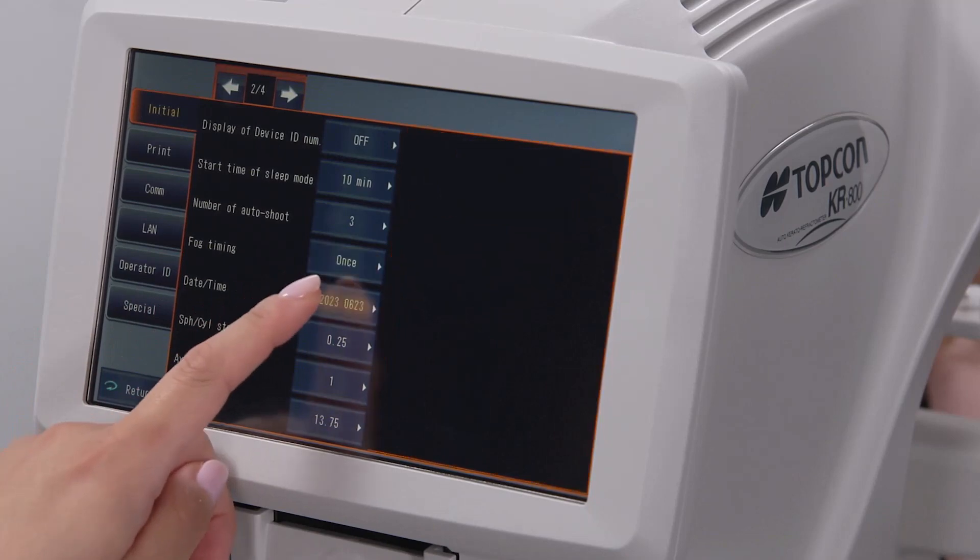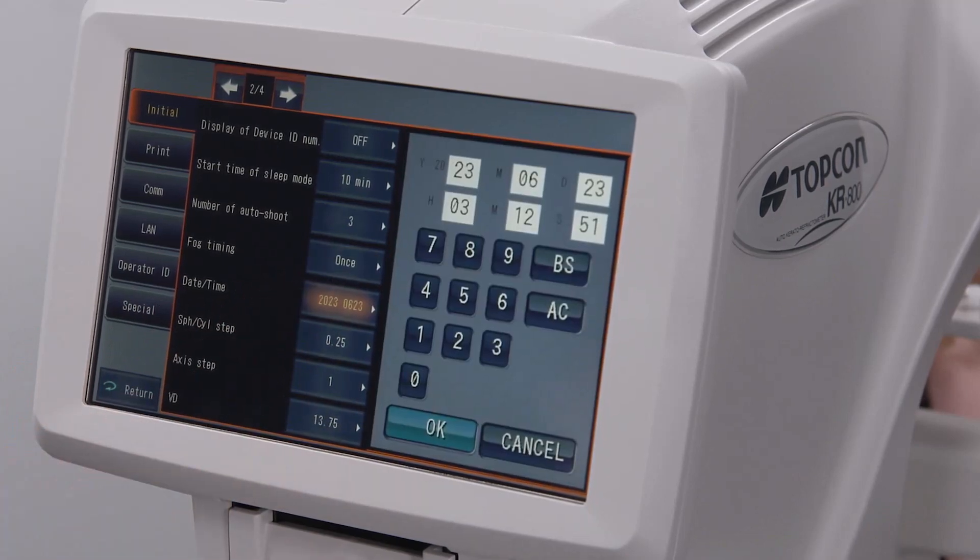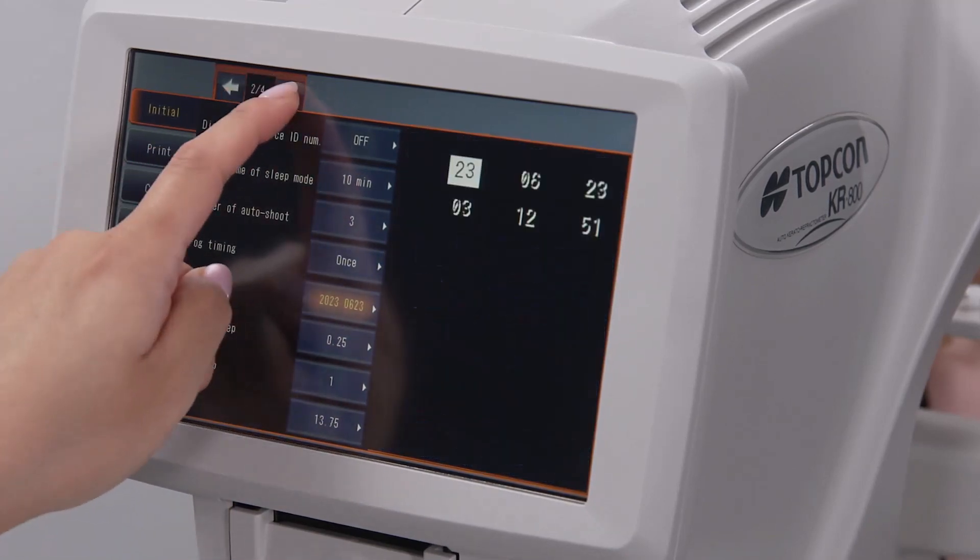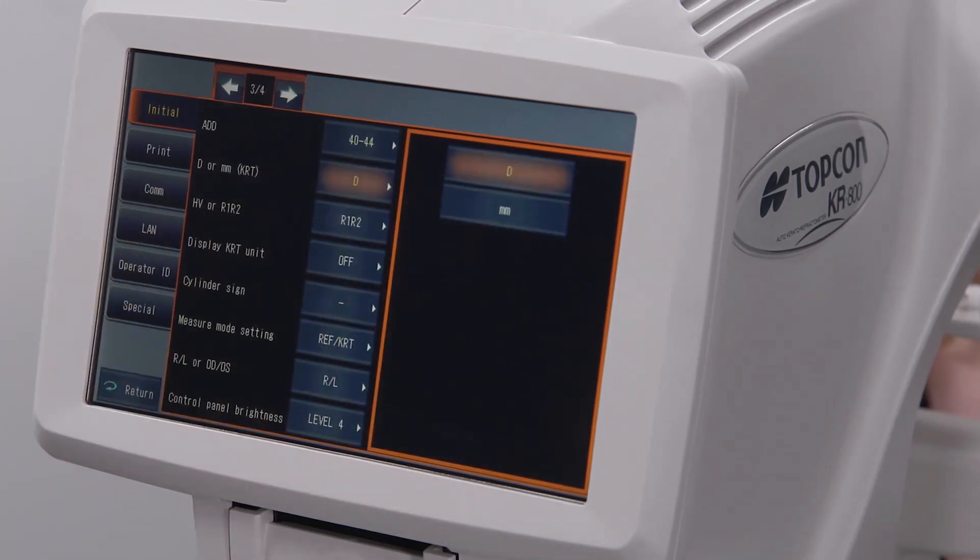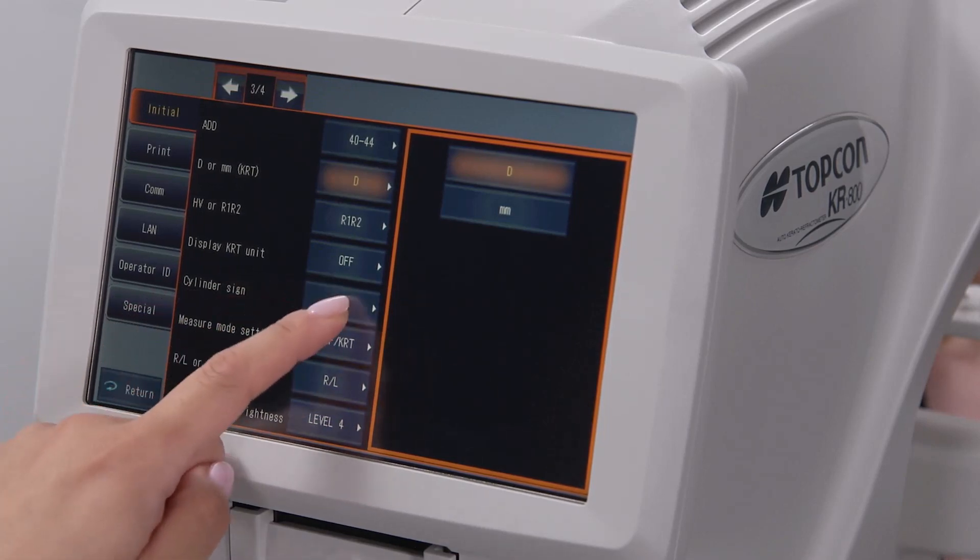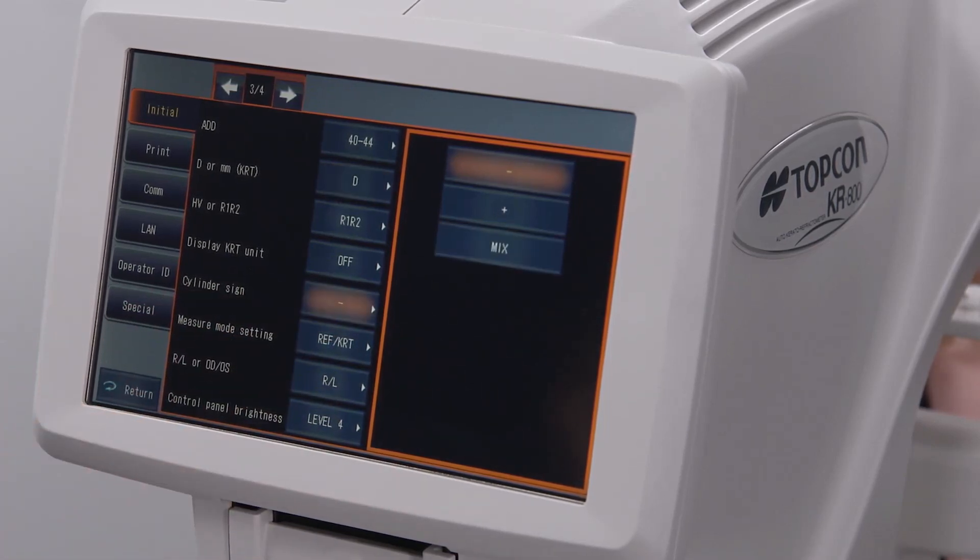Date and time allows you to set the current date and time. Diopter or millimeter determines the units of keratometry. Cylinder sign determines whether the autorefraction results will be displayed in plus or minus cylinder.